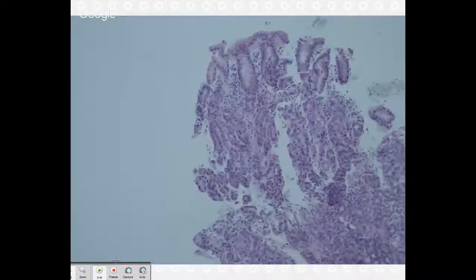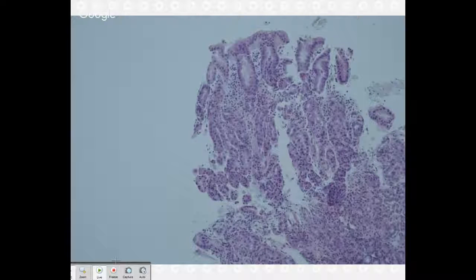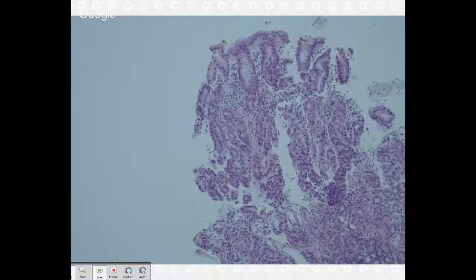I'm just going to leave this sitting right here on a nice view and talk. So they work in the same way. So your Taxols and your taxanes, for boards, this is something that could come up. They bind microtubules, and so they prevent microtubule depolymerization. So practically what that means is your mitotic figures, when they're trying to pull apart, they can't. They get stuck in metaphase because the microtubules can't depolymerize. And so you see these ring mitotic figures because they're trying to pull apart and they can't. So that's where we get the ring mitotic figures.